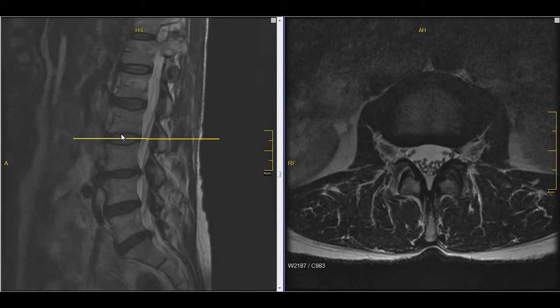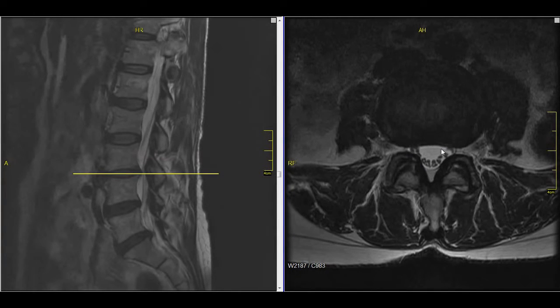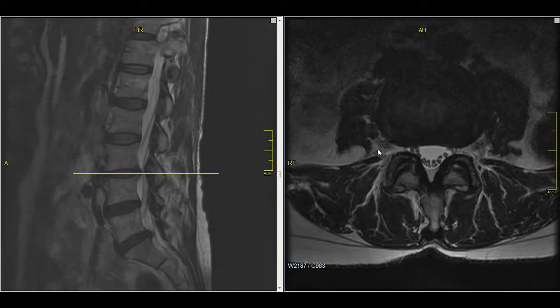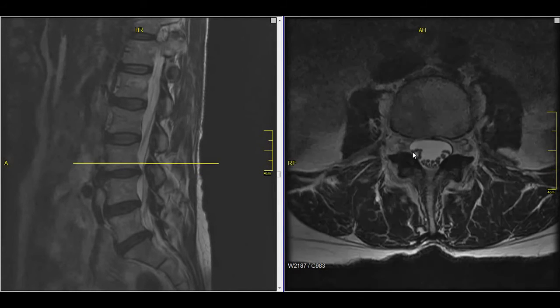At this level, which is L2-3, we see those two nerve roots in the subarticular recesses and they're okay. If we go to that L3-4 level — remember we saw a little bump there — we can look at this and say that although it's a little narrower, the nerve is still basically okay there. This would probably not cause pain. We have to put it together with where the pain is, and in this particular person, it would not be the explanation, as their pain was down the back of their leg, not the front. The L3-4 level — that L4 nerve goes down the front of the thigh.